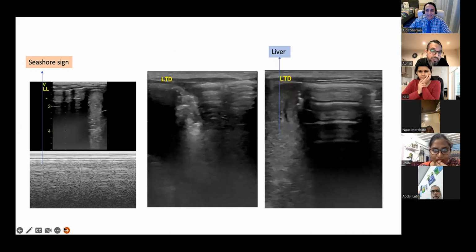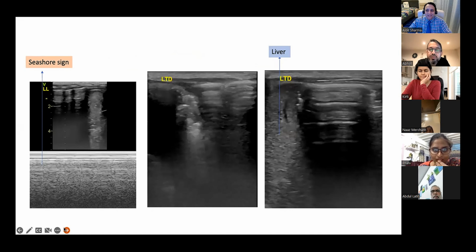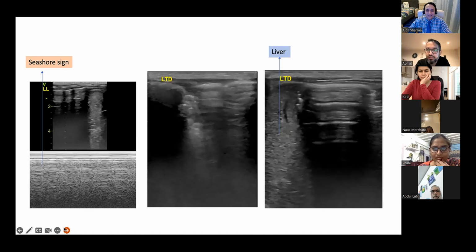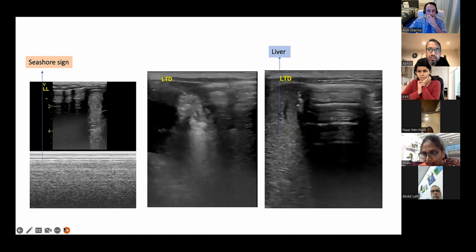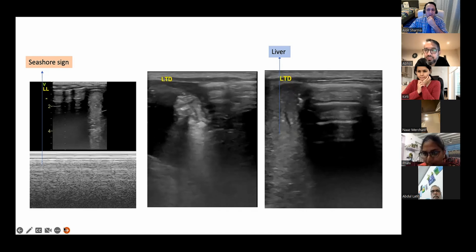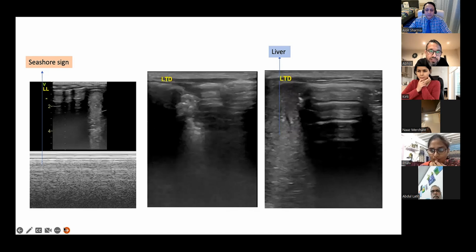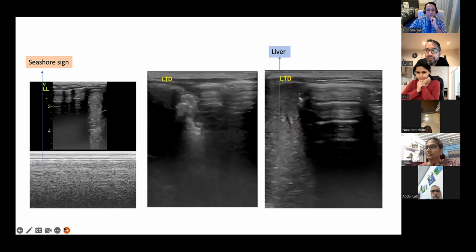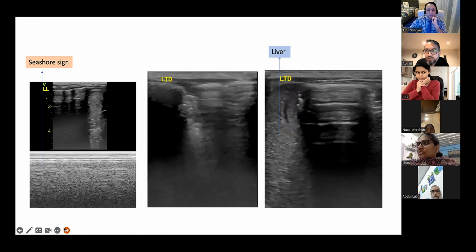Lovely images, Katie, but there is not much information to say how much the depth was at that point on your scans. So I can't really comment. Ideally your depth should be around 3 to 4 centimeters, and it would have been easier to comment on the scans when you have those depths and your focus marked on the screen.